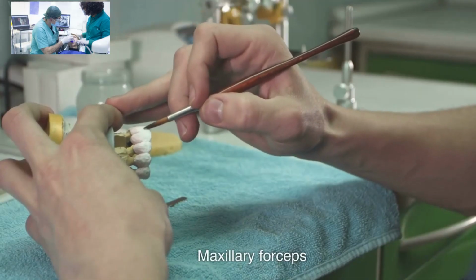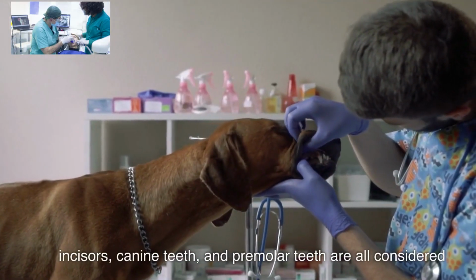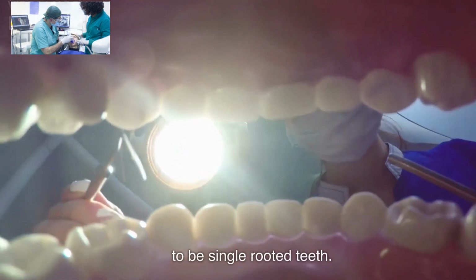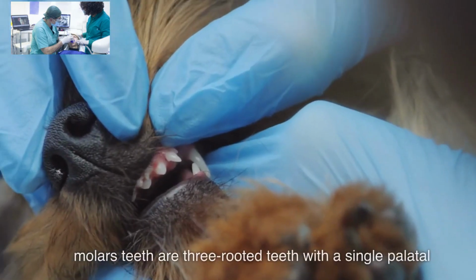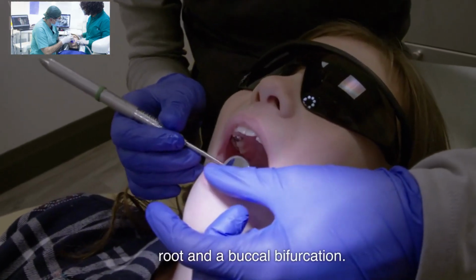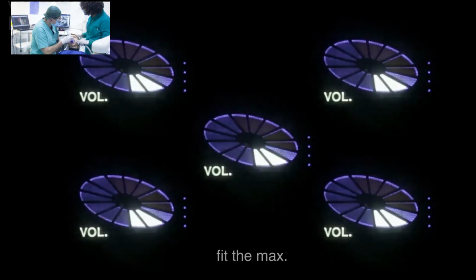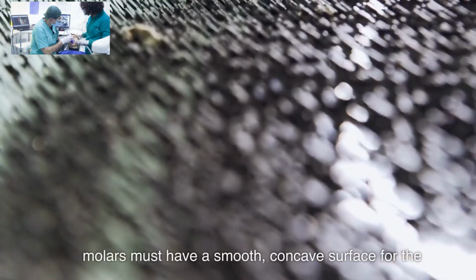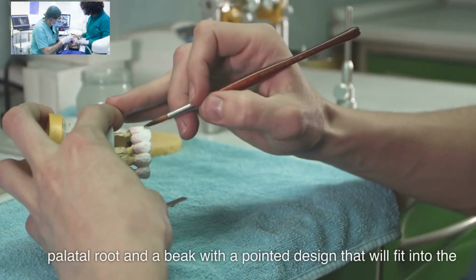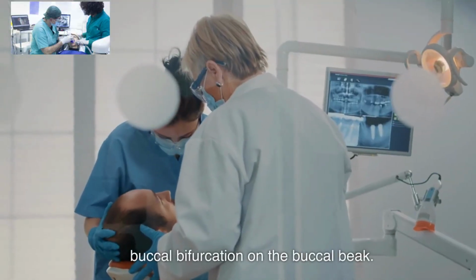Maxillary forceps. The maxillary incisors, canine teeth, and premolar teeth are all considered to be single-rooted teeth. The maxillary molar teeth are 3-rooted teeth with a single palatal root and a buccal bifurcation. Therefore, forceps that are adapted to fit the maxillary molars must have a smooth, concave surface for the palatal root and a beak with a pointed design that will fit into the buccal bifurcation on the buccal beak.